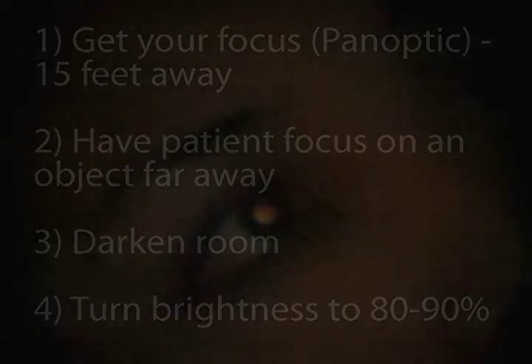Now we're ready to look into the eye. The first and most important step is looking for the red reflex. To do this, hold your ophthalmoscope approximately 2 feet away from the patient's eye at an angle about 15 degrees from center. This will position you in the direction of the patient's blind spot in line with their optic disc, and also will help prevent pupil constriction. Here is a good example of the red reflex.